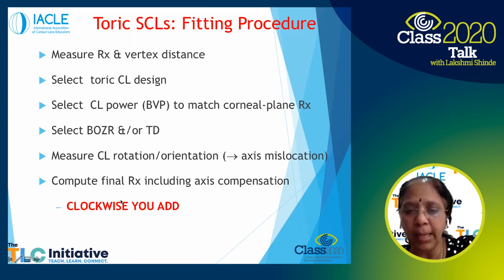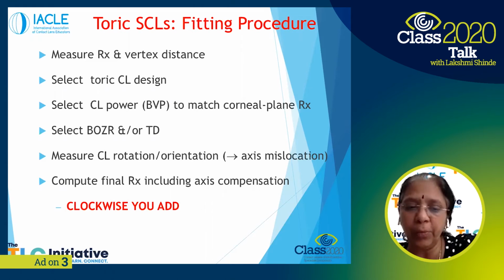And you fit the contact lens, look at the axis location, compensate for that, and then after that, you prescribe the lenses. And of course, you have to apply the last rule if there is any rotation. So clockwise add, anti-clockwise subtract, or left add and right subtract. Left add, right subtract is from the practitioner's point of view.